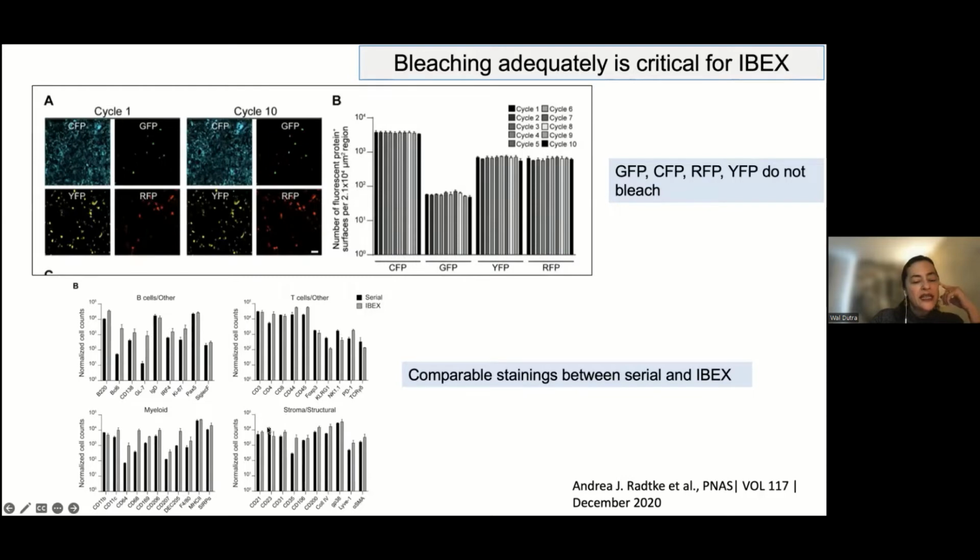showing that you can really see an excellent expression of the different molecules using both methodologies, which means that obviously using the one slice of tissue will give you an easier and more reliable way of doing it. And of course, will also save material. Sometimes you can only get access to one slice of the tissue. Perhaps this will be used for other diagnostics and things like that, and you don't have access to many different slices. So using one slice also provides you with the opportunity of staining many different markers without using up a lot of your material.